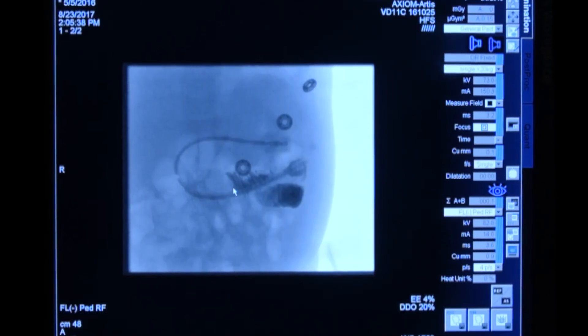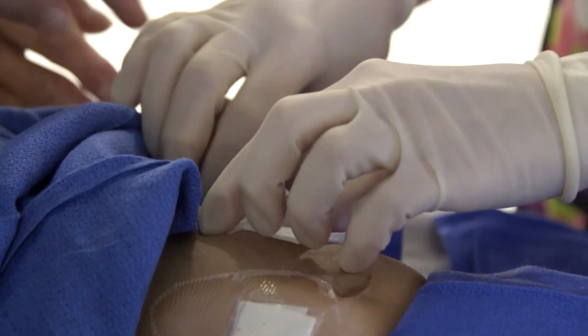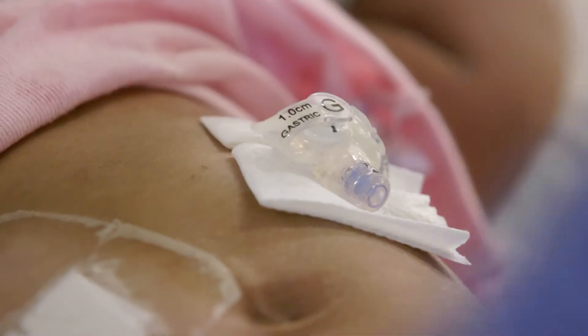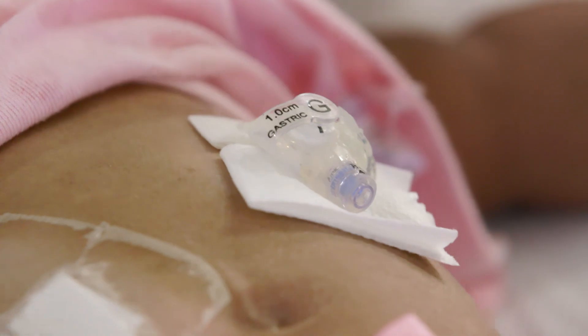Then I can inject the jejunostomy port with contrast to confirm that the tip's in a good position. I usually try to leave the tip of the catheter right at the duodenal-jejunal junction. The nice thing about the gastrojejunostomy tube exchange procedure is that I don't need to use sedation. It's minimally painful, children tolerate it very well, and it's a wonderful way to exchange the feeding tube and maintain patency without having to use any sedation or anesthesia.